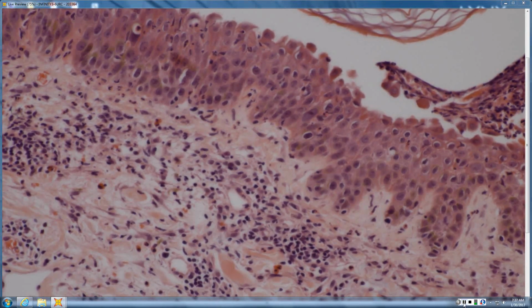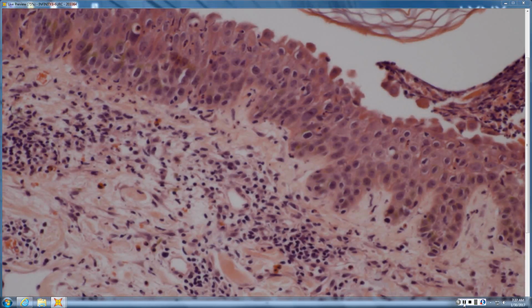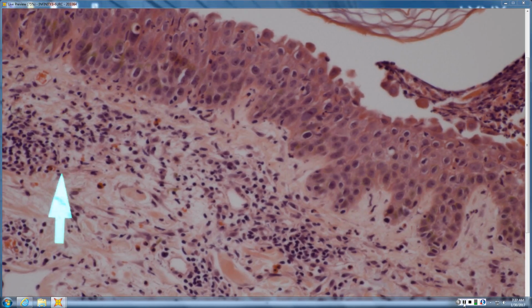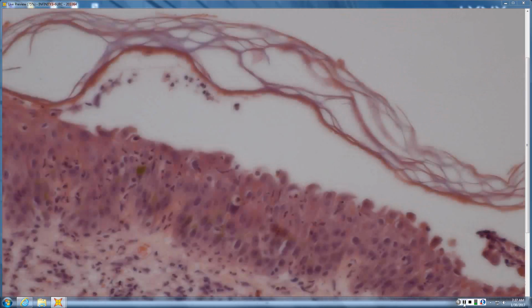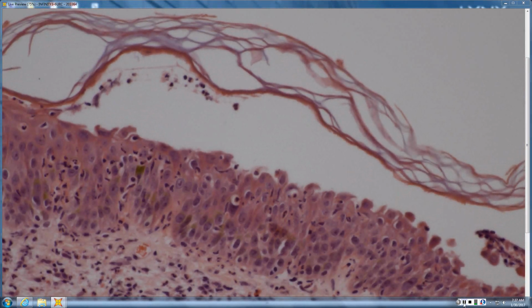So what would be your differential for a superficial acantholysis? So superficial acantholysis could be pemphigus foliaceus, staph scalded skin, bullous impetigo itself. That's a pretty good differential. There are eosinophils, which could lead you to think of pemphigus foliaceus. I don't see them particularly in the epidermis. You certainly would want to correlate with clinical and also get immunofluorescence. The history on this one was just bullous impetigo.